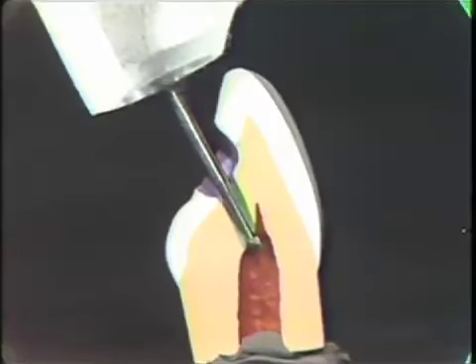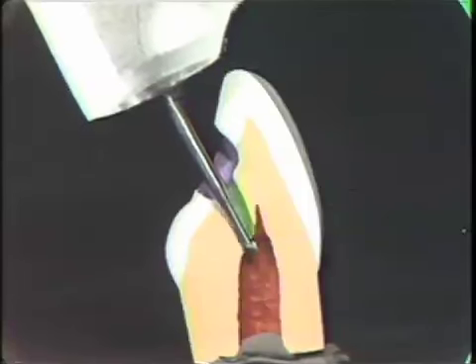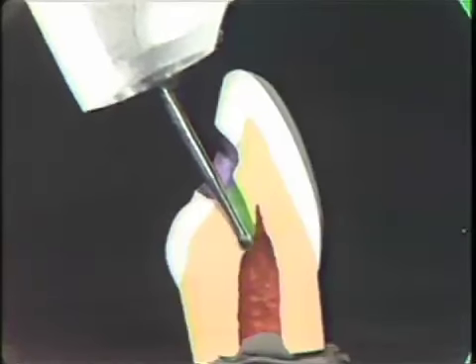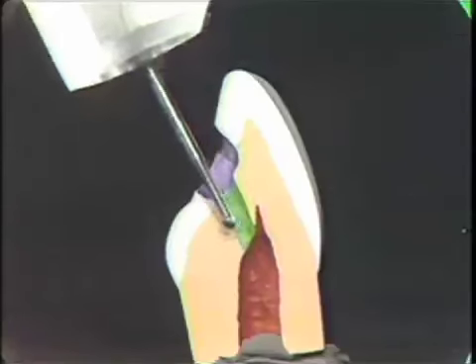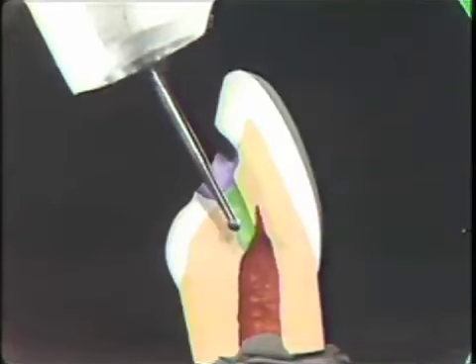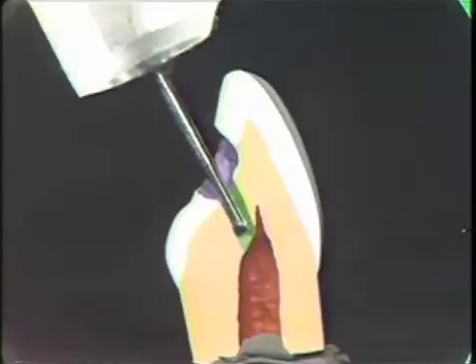Once again, you'll feel the burr fall into the pulp chamber as there's a sudden reduction in the drilling pressure as you enter the pulp. Now, if you really get lost and you feel like you just don't know where the pulp is or what the angulation of the tooth is, you may want to stop and take a radiograph.